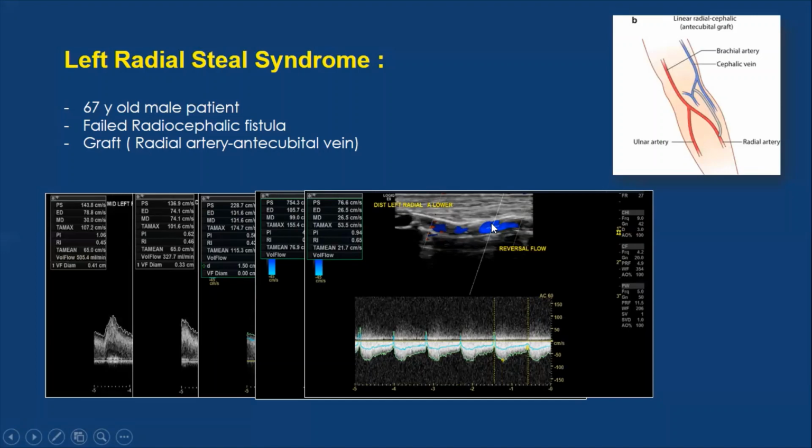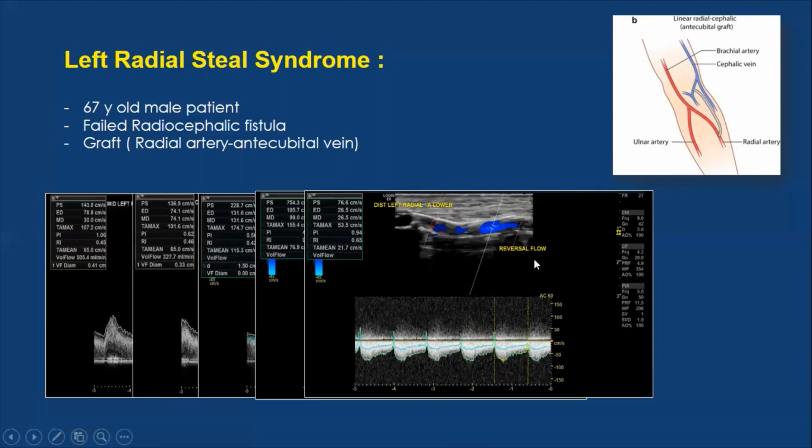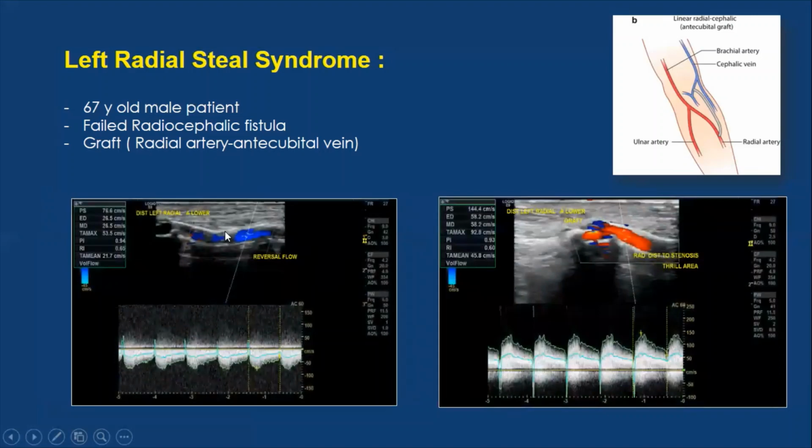This is why we have to make sure that our settings are correct, and that we are interpreting the normal flow direction correctly, the map is correct, and there is no invert button activated. So the sonographer has just steered the color box.